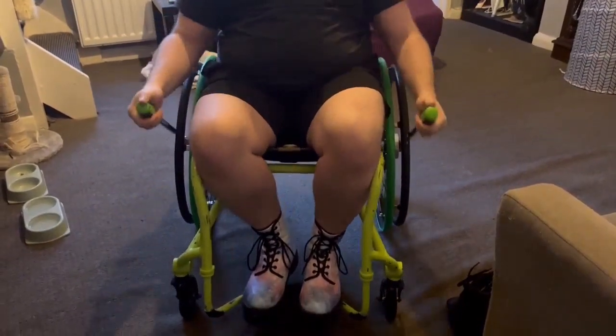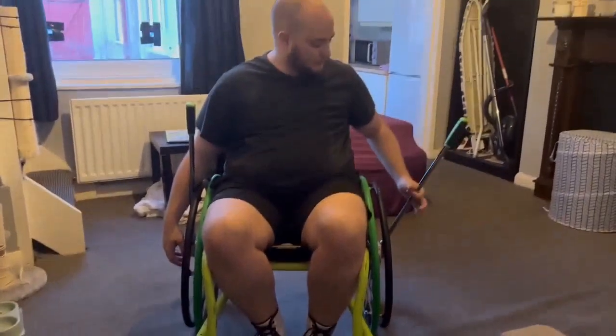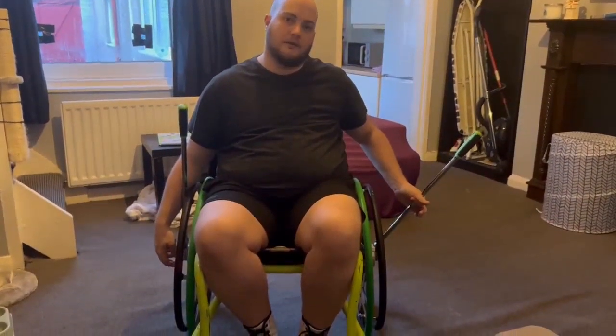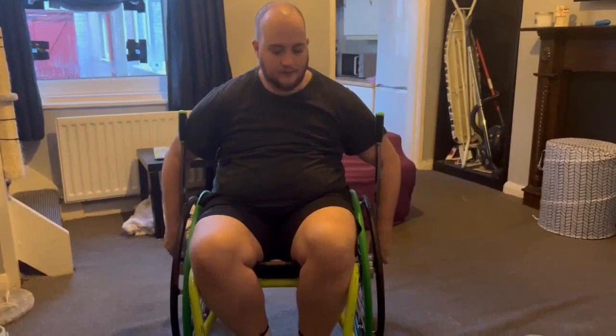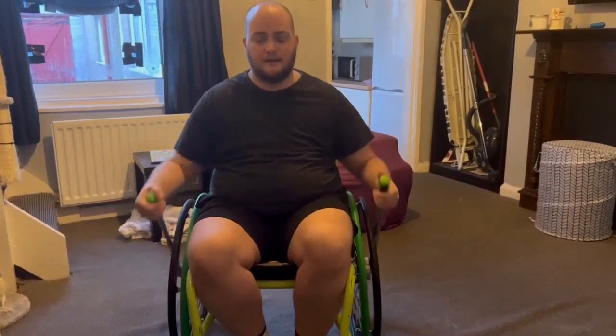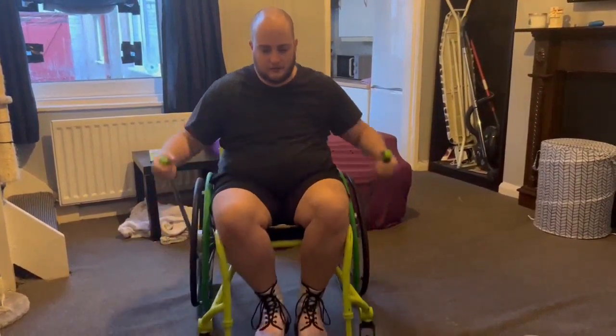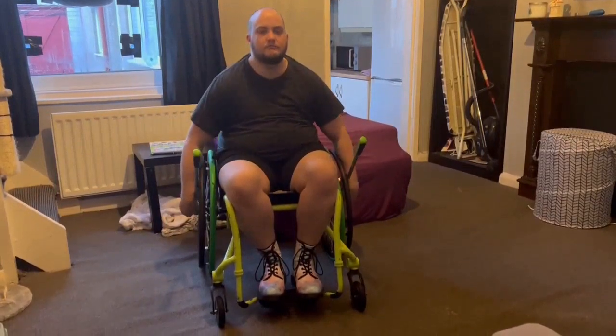If you don't have rubber push rims like me, you can just glue a piece of rubber around the lever drive here. That's how it works. If you want to back up, I can get about a quarter of a push just by pushing in on the rims and pushing back. And if I want to go farther than that, it's just change the direction of the handles. Easy peasy.